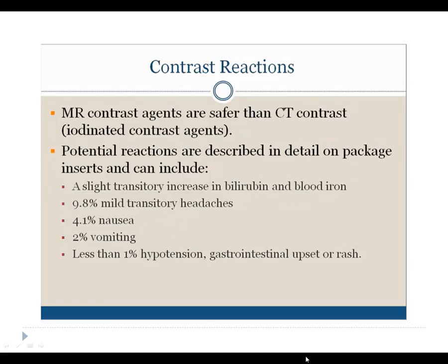In most cases, we will be on hand injecting our patients for routine protocols, but for some, where we need to use the power injector for a dynamic injection, we may not be able to talk to the patient until after the dynamic sequences has run. In these instances, it's very important to watch the patient for any signs of distress and be ready to assist the patient if necessary.